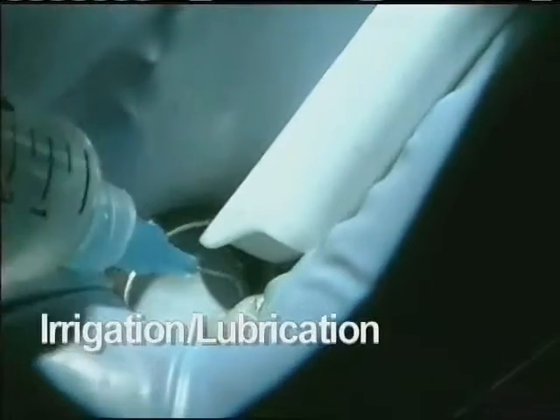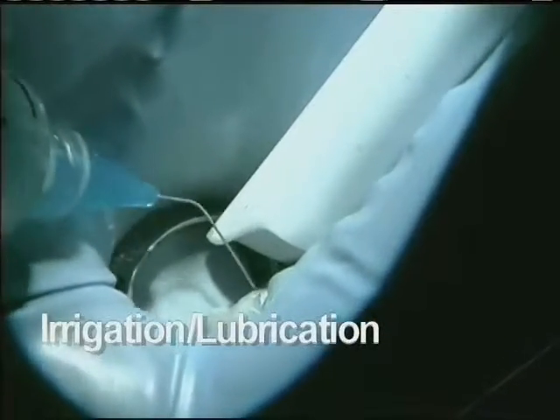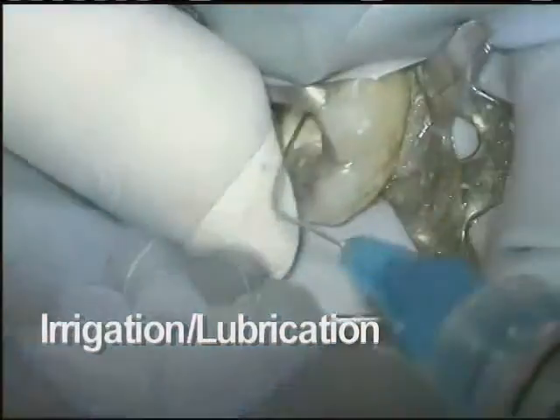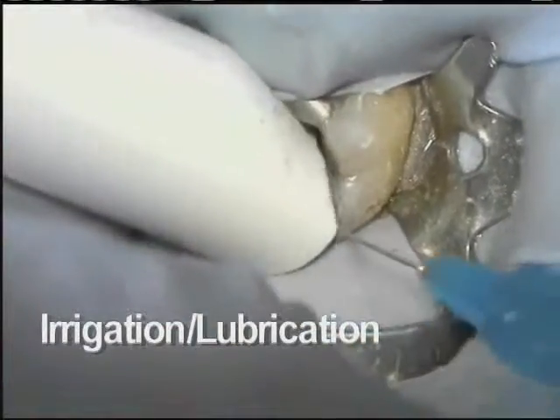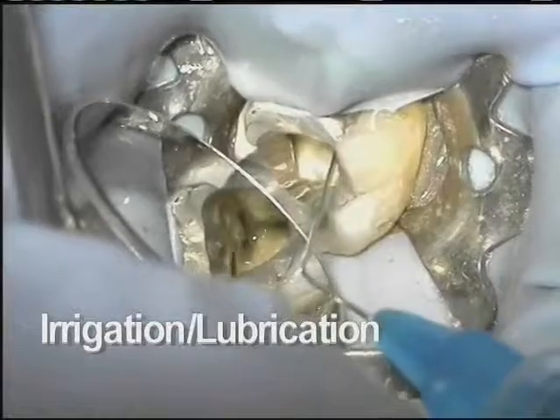Throughout the procedure, use of sodium hypochlorite and a lubricant such as ProLube is strongly suggested. These help by digesting tissue and clear the way for files as they work their way down the canal space.